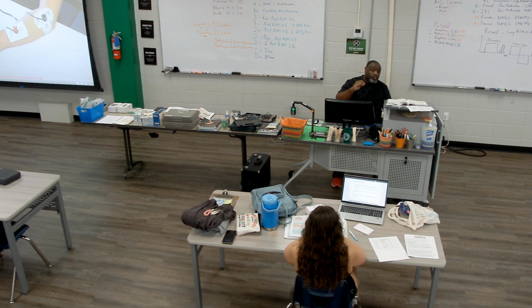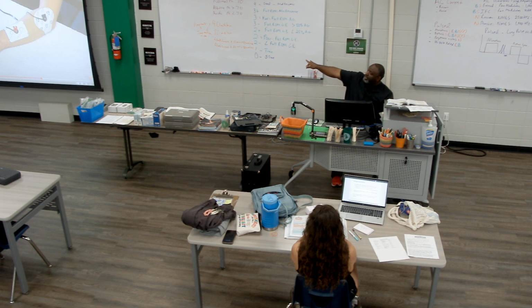Then you will set the amplitude of your current, and depending on the amplitude of your current, that's going to determine your actual treatment time. Does that make sense? So if the patient can only tolerate 2 milliamps of current, what should take only 10 minutes is going to take double that amount of time, because they can only tolerate half of the dosage current that we normally would believe. So actual treatment time versus prescribed treatment time is usually different using iontophoresis.